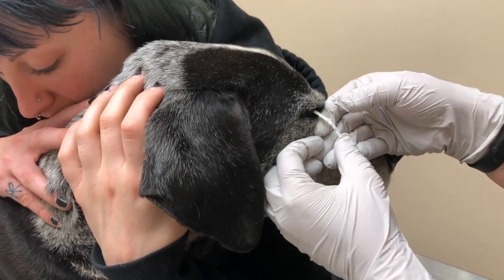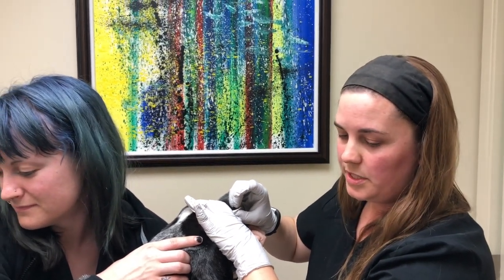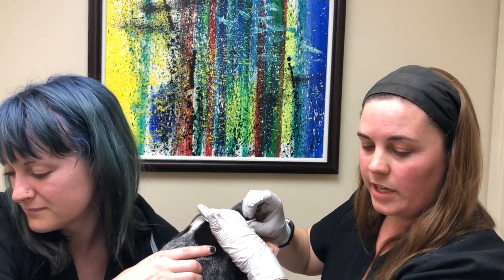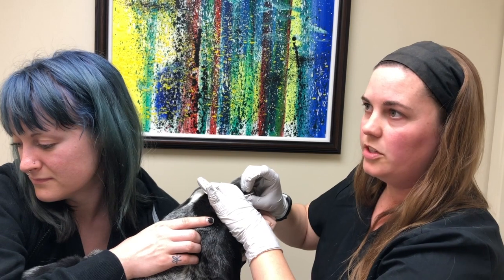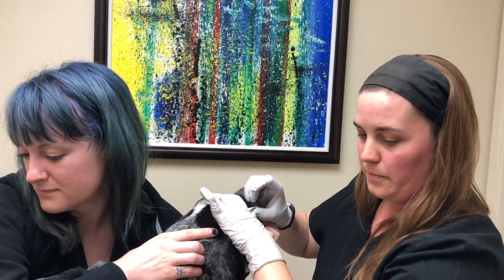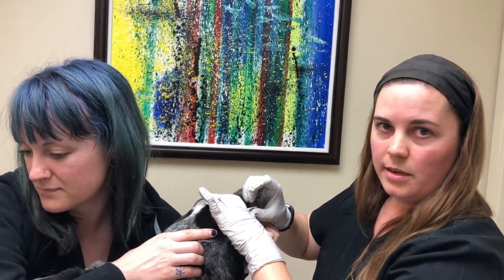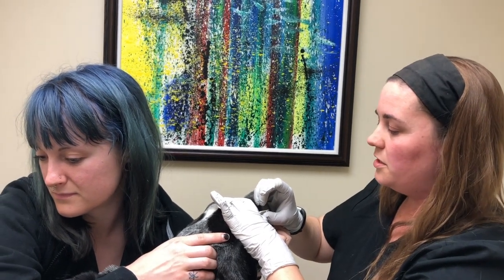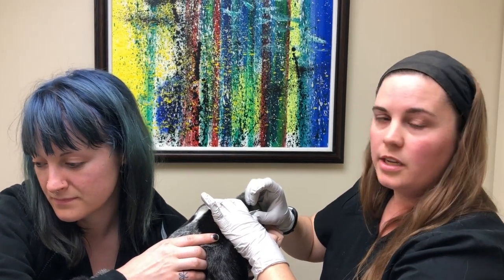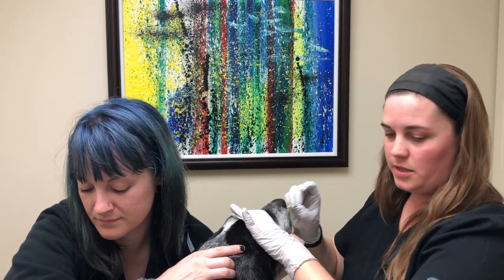So we're going to leave it there for 60 seconds. So if our reading is between 10 and 15 millimeters of wetting per minute, this is borderline treatment of KCS, keratoconjunctivitis sicca. If there are clinical signs of this, we want to start treatment right away. If it's below 10 millimeters of wetting per minute, you definitely want to start treatment for it. Otherwise, if we're at 15 and above, we're in an ideal range. In a minute, we are at 15, so Austin has good tear production.